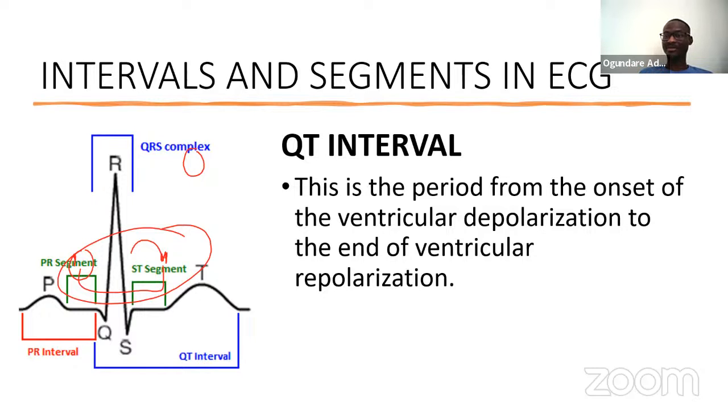If you don't know what the PR interval represents, how to measure it, where to measure from and to, then you can't make sense out of ECG. Okay, and this is why this class is very important. And I'm happy some of us are getting it already.